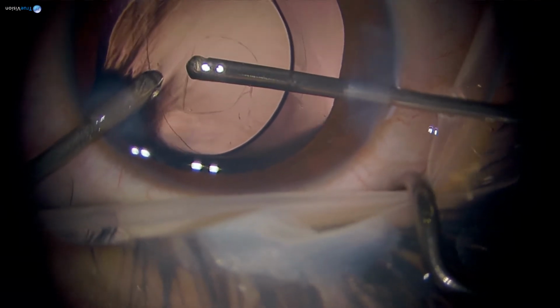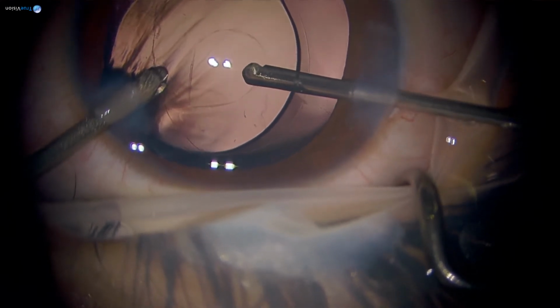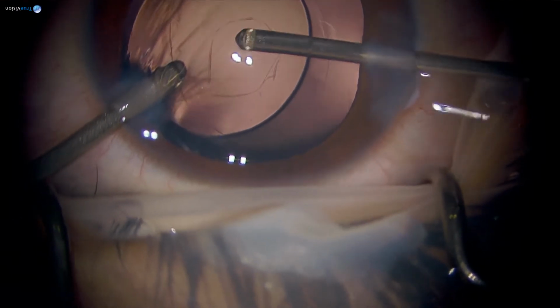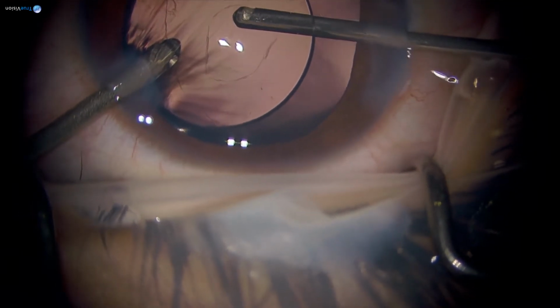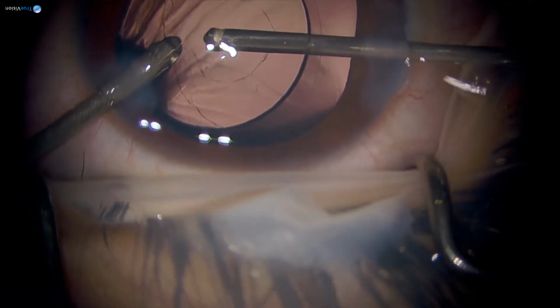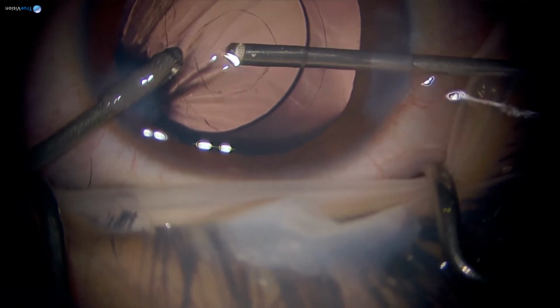I used to do very deep. Then what happens is that the eye becomes so soft, you can't even implant a lens. So it's not even required to disturb the vitreous so much. So at this point of time, I'm done with the left part of this capsulorhexis. You can see I'm stopping here for a bit.